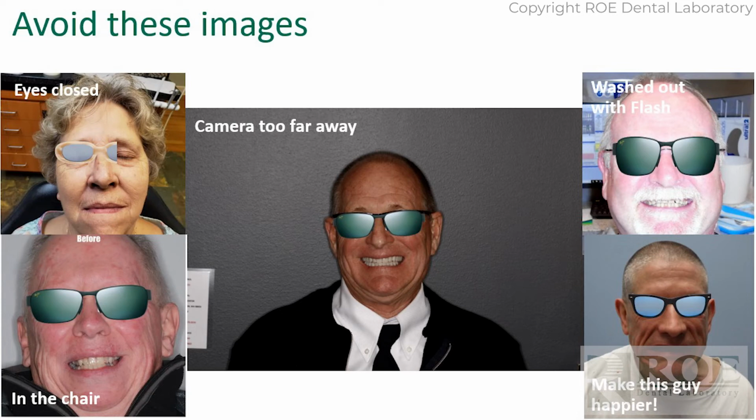Top left, patient's eyes are closed and there's no teeth, right? So we don't want that picture. The one in the middle, it's really too far away. We like to zoom in, we like to crop, give a beautiful before and after. It's tough to analyze the teeth when you crop in and it's all pixelated.